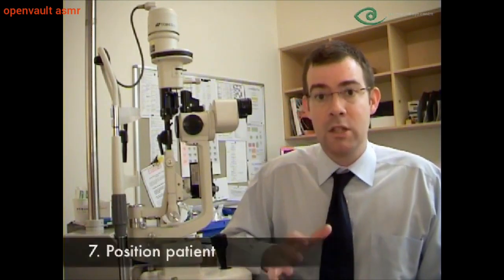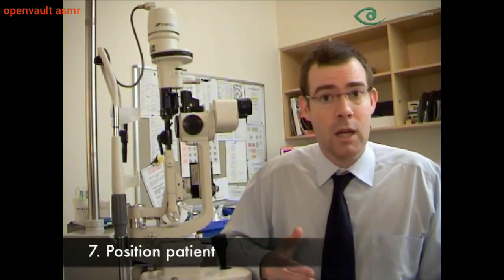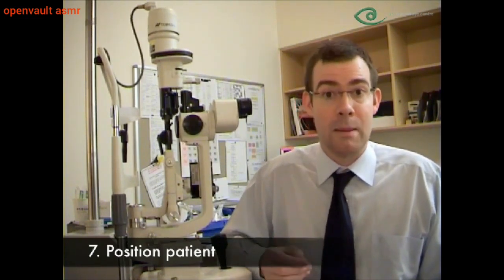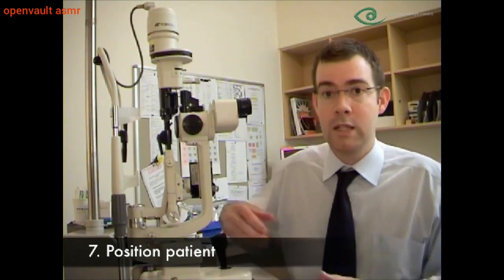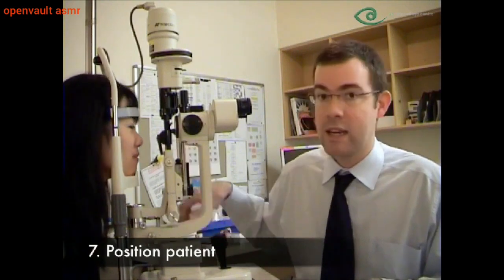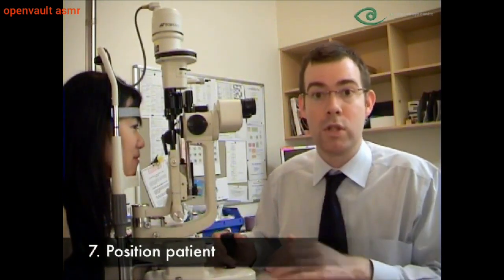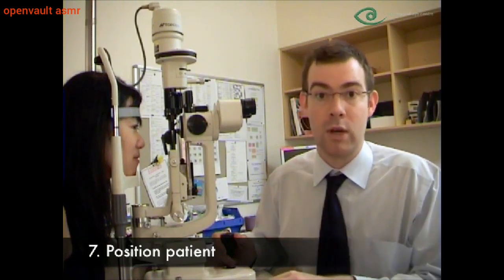The next step is to position the patient, which is probably the most important step, both for patient comfort, but also to assist you in performing a good examination. You want to ask the patient to lean forwards and place their chin on the chin rest and forehead against the bar. Ask them to keep their teeth together and breathe through their nose to prevent their head lifting up and down with each breath.